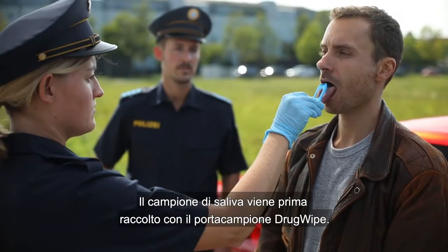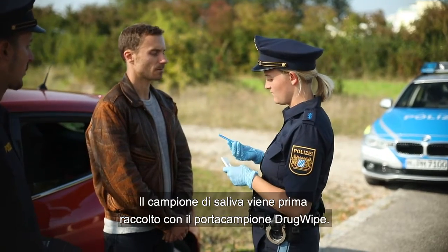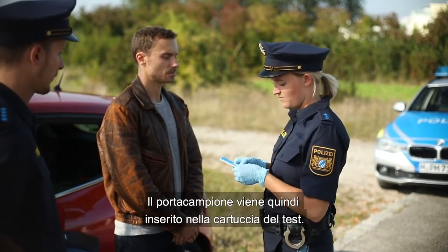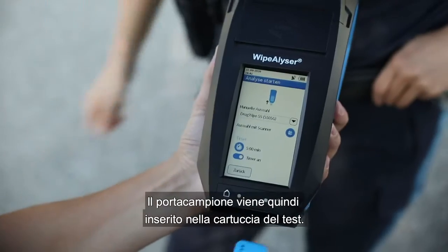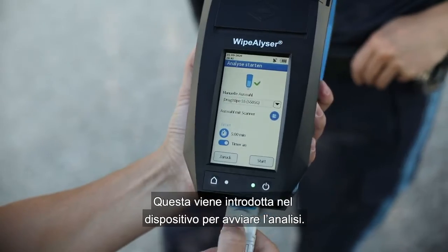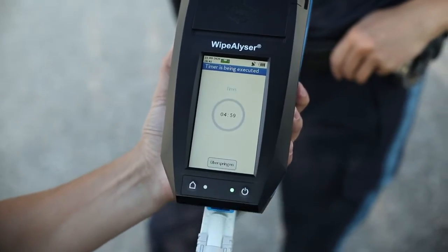The saliva sample is first collected using the Drug Wipe Sample Collector. The collector is then placed in the test cartridge, which is inserted into the device and the analysis is started.